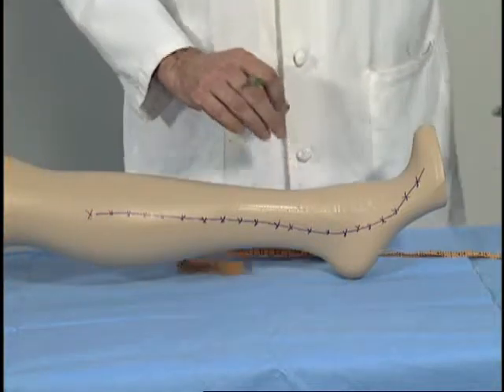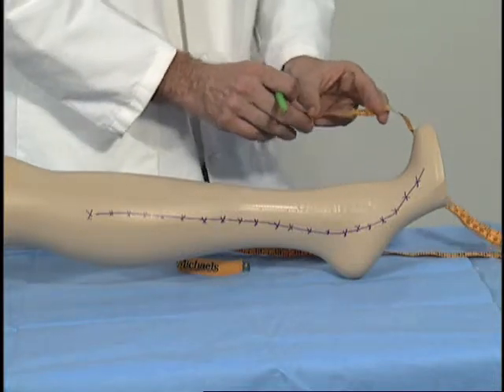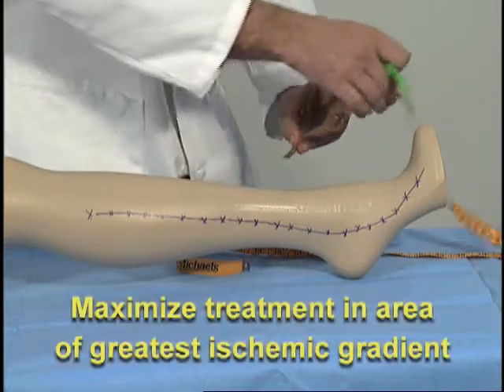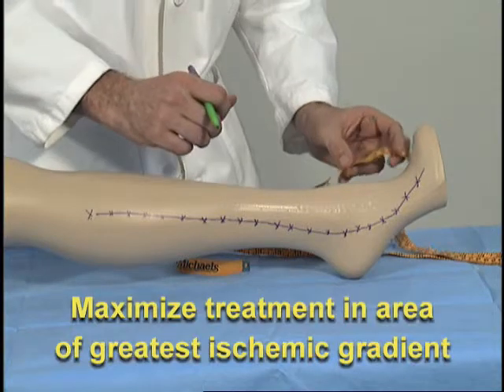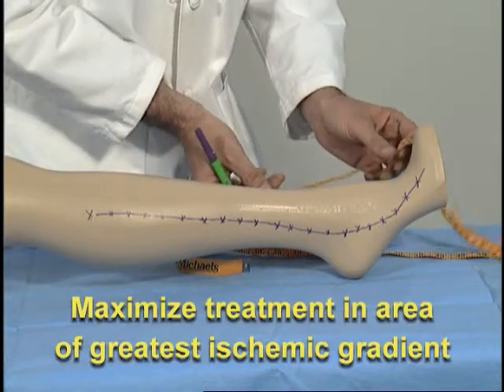So we're going to start distally, since this is foot ischemia, and we're going to try to maximize our treatment in the area of the greatest ischemic gradient, and we're going to be able to treat 20 centimeters.